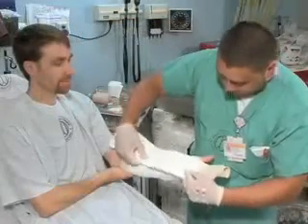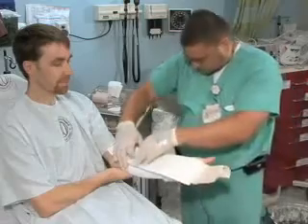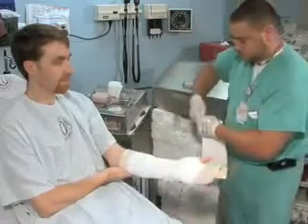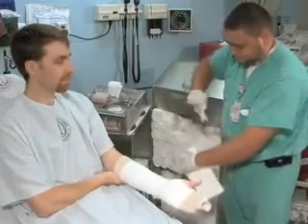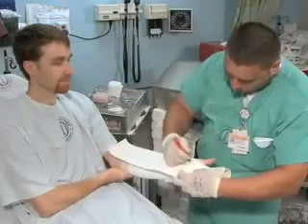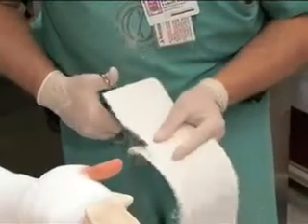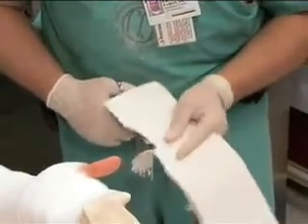Select a piece of dry plaster that is slightly wider than the limb to be immobilized. Measure the length of the splint material required, and then cut or tear the dry plaster material to the appropriate length. Use at least 8 layers of plaster material for upper extremity splints and 12 layers for lower extremity splints to provide adequate strength to the completed splint.